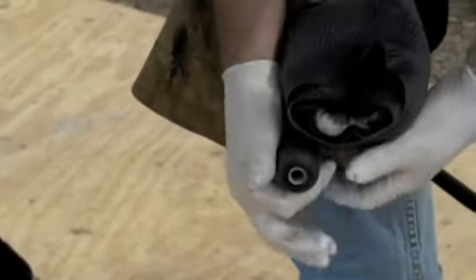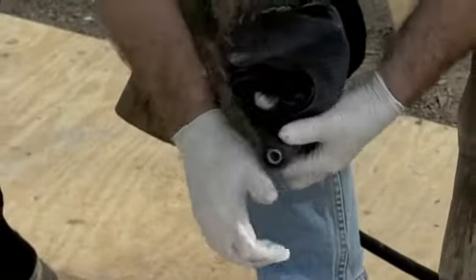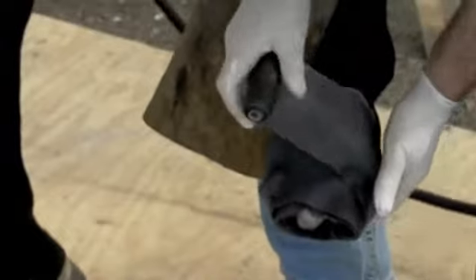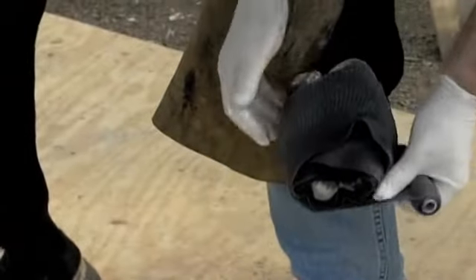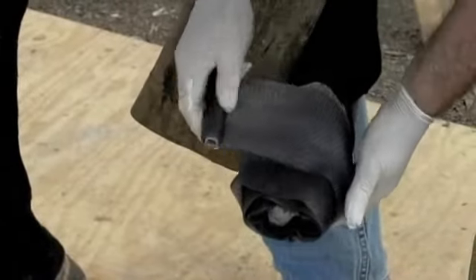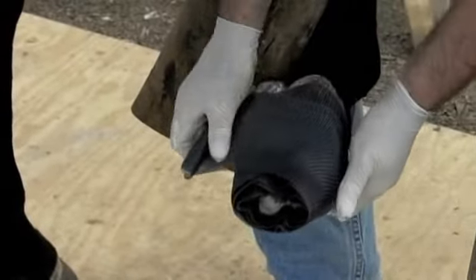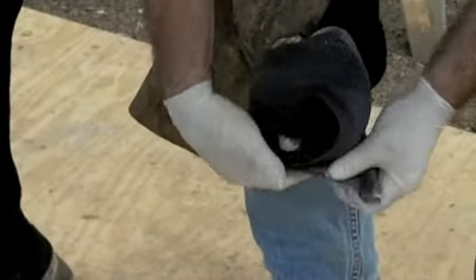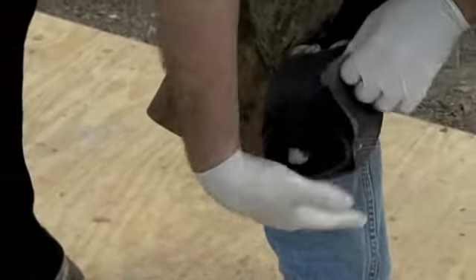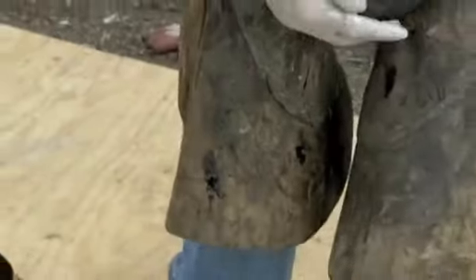As always, make sure when you're wrapping the foot that you have plenty of material at the toe. You have to make sure that you've always got some of the casting material at the point of breakover. If you're having trouble with cast lasting, it's generally because you're not adding enough cast to the point of breakover at the toe. Also make sure that you do a nice rocker roll on the toe.